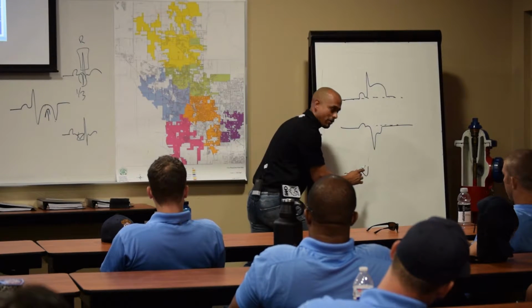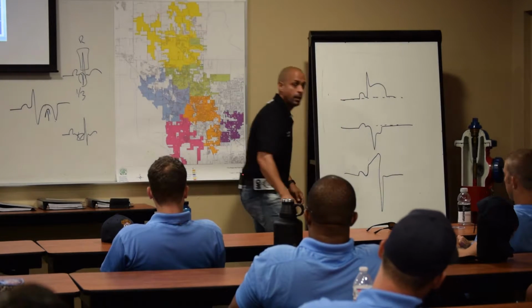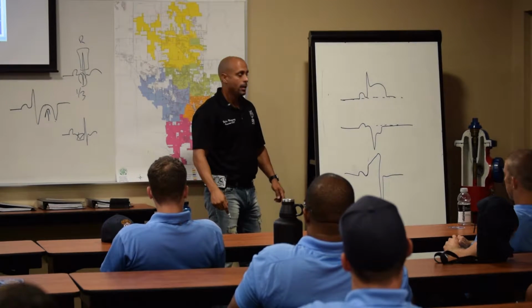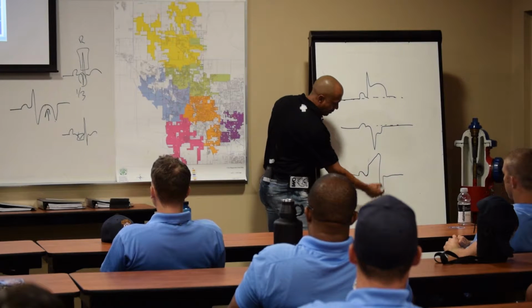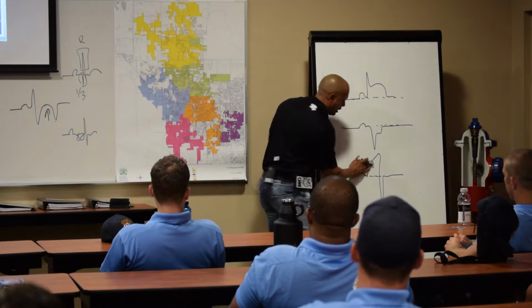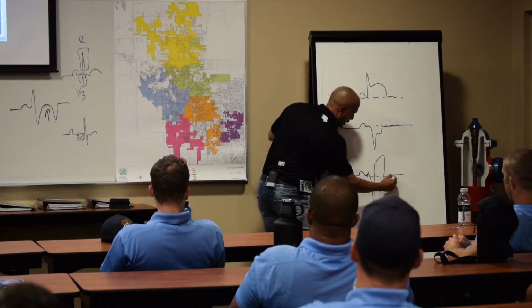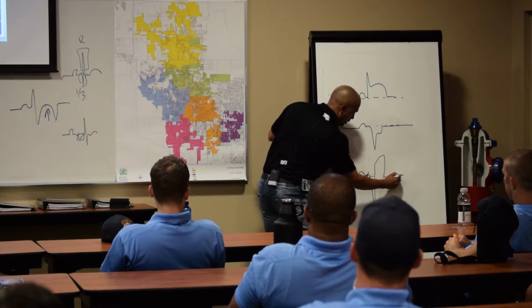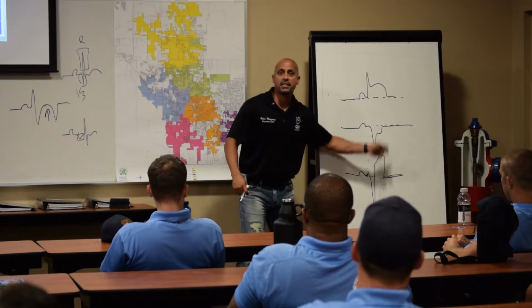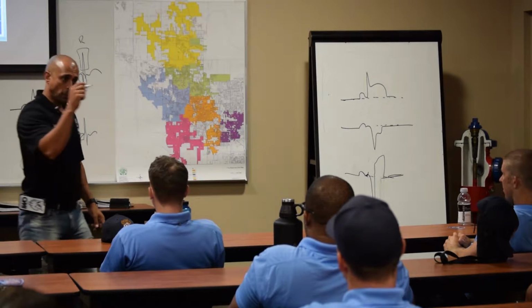Versus, I have to think about my picture real quick. So my ST segment is high, but most of my QRS is where? Opposite. So are we on two different sides? Actually, it should be the other way around. I'm discordant. That's what I meant to do. So, are we on opposite sides? So it's discordant.